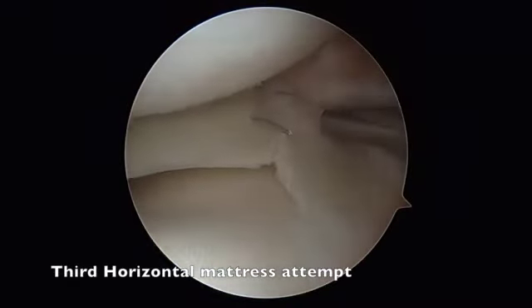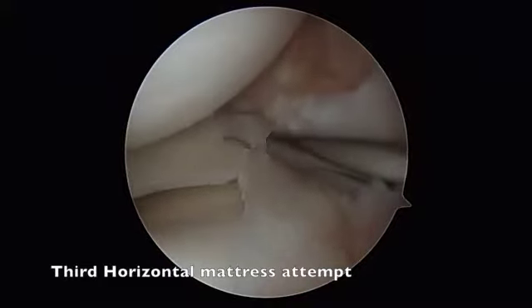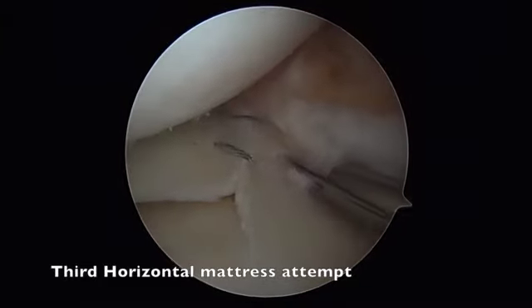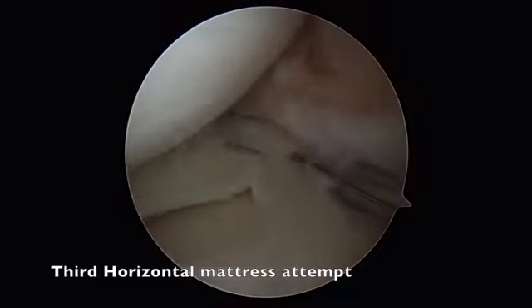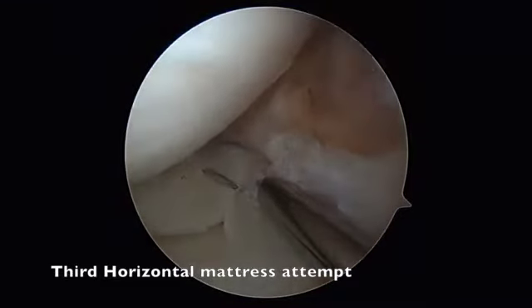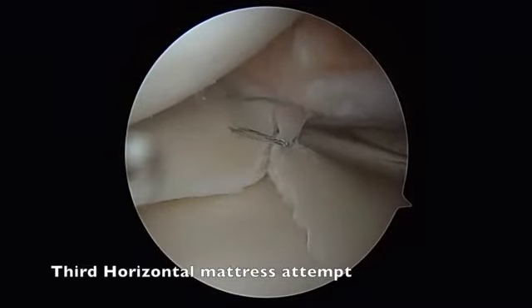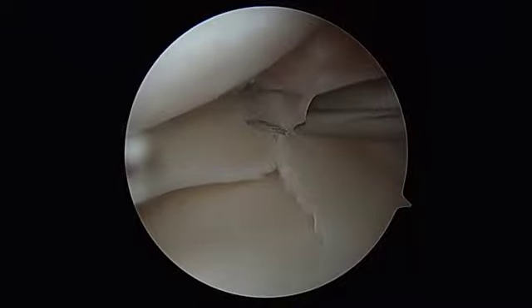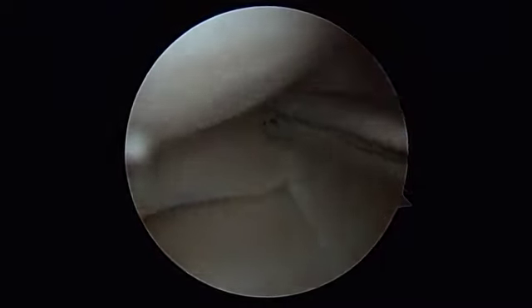A third 2-0 mini-suture tape meniscus repair needle is introduced through the zone-specific cannula. In this instance, an oblique-type mattress stitch was created by crossing the tear in an oblique fashion on the second pass of the 2-0 suture. Customarily, at least three sutures are placed; however, the number of sutures and orientation are determined by doing what is required to achieve a successful reduction.